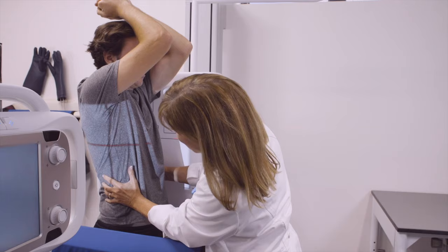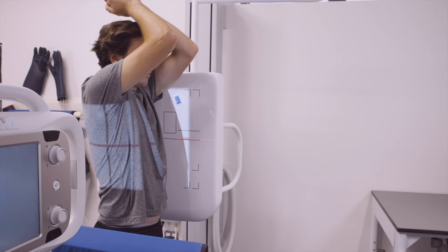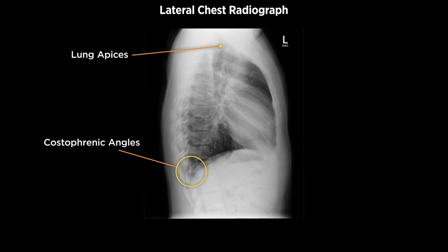As I walk away I need you to take a big deep breath and blow your breath all the way out. Take another big deep breath in, don't breathe, don't move — and the exposure is made. A diagnostic lateral chest radiograph should be free of motion and rotation, include both lung apices and costophrenic angles, with the hilum centered and the sternum in profile.